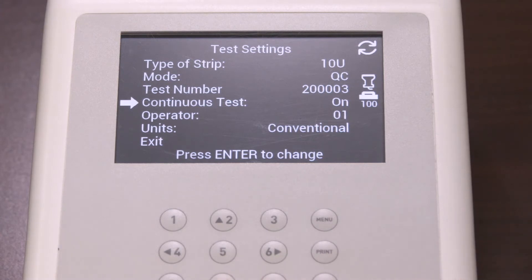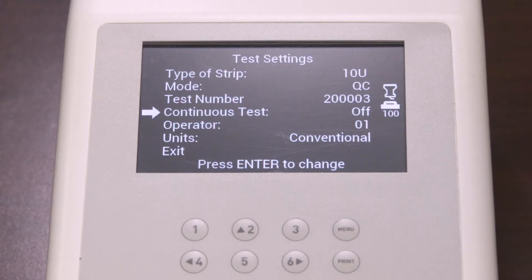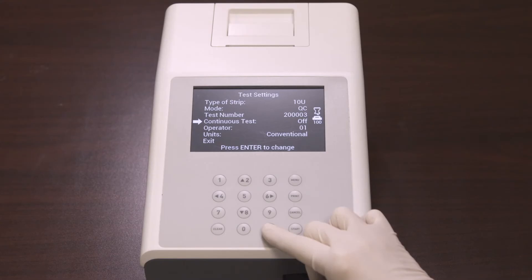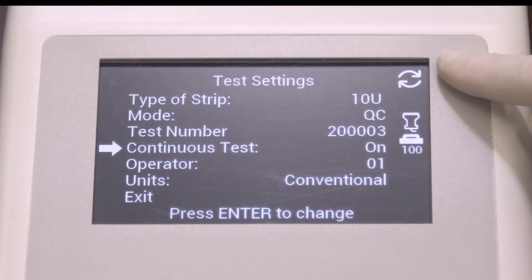Next in the test settings, after test number, is continuous test. Select continuous test and press enter to cycle the settings to off or on. If continuous test is off, you can test one strip at a time, which is also called single test mode — this performs 60 tests per hour. If continuous test is on, you can use test strips one after another; continuous test mode performs up to 120 tests per hour. The circled arrow symbol will be displayed when continuous test is on.